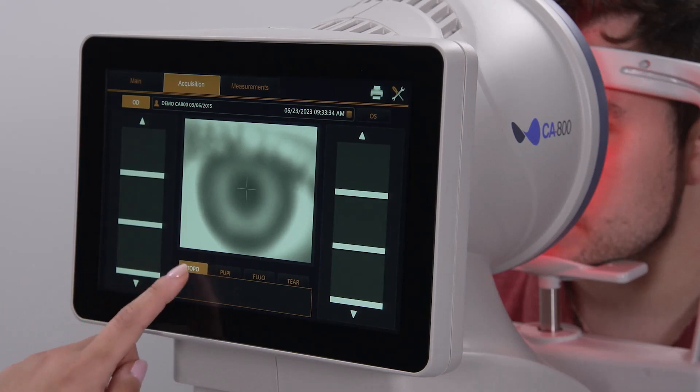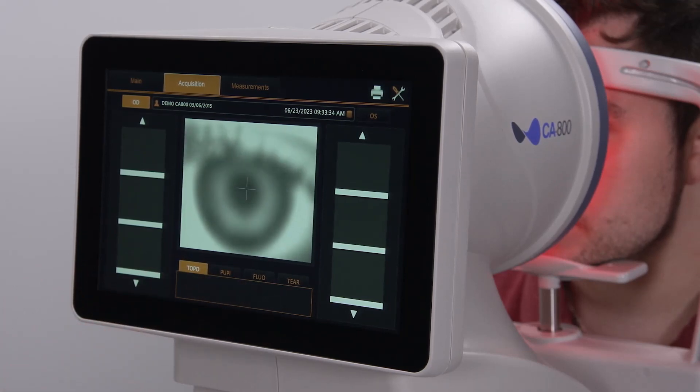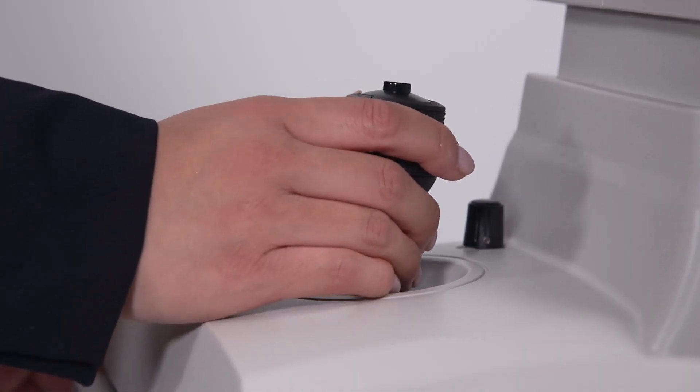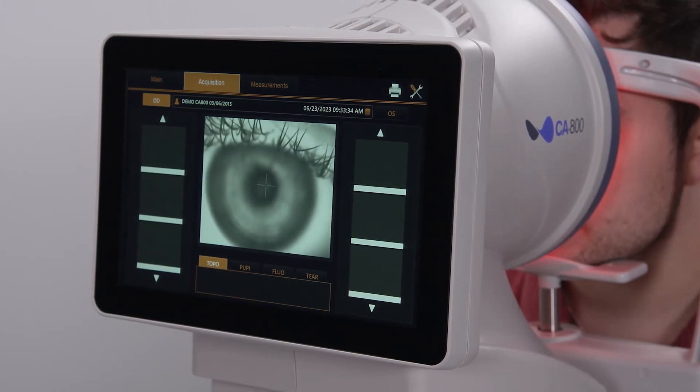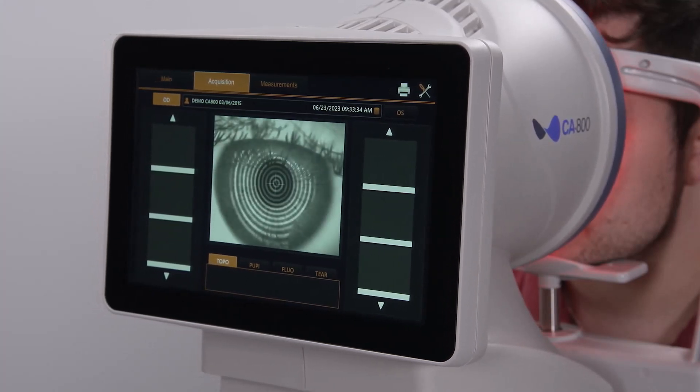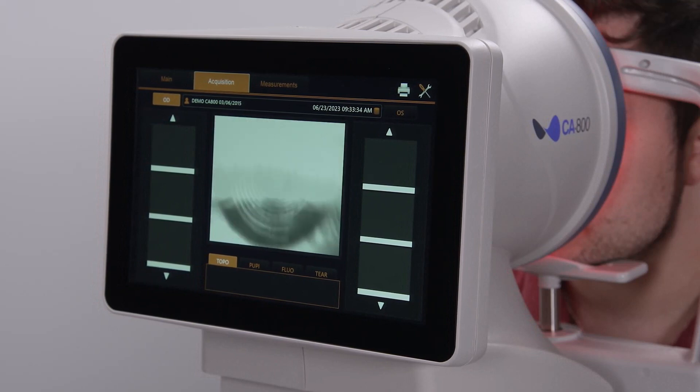Select the Topo tab at the bottom of the screen, and the patient should continue to blink normally and look at the target in the center of the red rings. Use the joystick to move the device towards the patient until the circular rings projected on the surface of the eye come into focus and are centered over the square target in the middle of the screen.